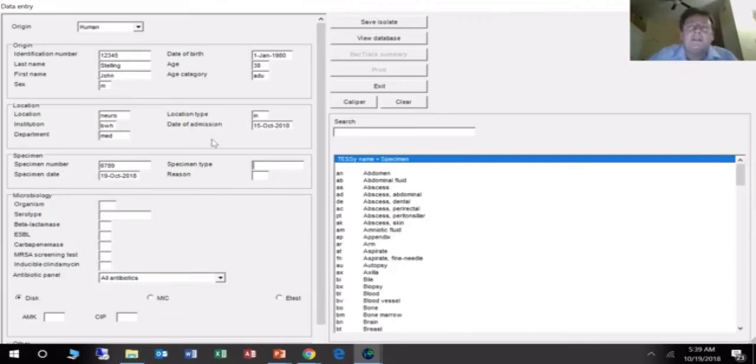So this is useful. The GLASS definition of hospital or community is based on hospital day 3 and later. So if you have the date of admission, we can make that distinction. If you don't have that information, then we simply report to WHO GLASS that it's unknown. Well, if it's outpatient, it's outpatient. But if it's inpatient, we need the date of admission.